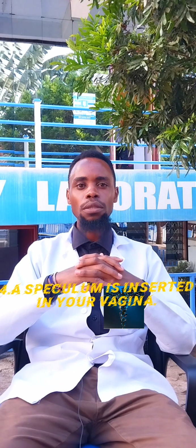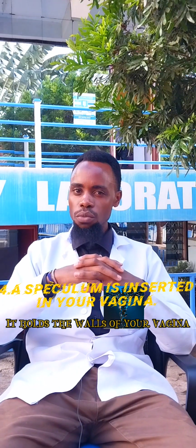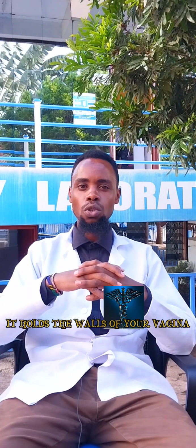Sawa sawa. Then after you've done that, your healthcare provider will insert a certain equipment known as a speculum. A speculum is an instrument that is used to do what? To hold the walls of your vagina, so that your healthcare provider can see the cervix, ama aone mahali ambapo ataweza kutoa ile specimen pale.